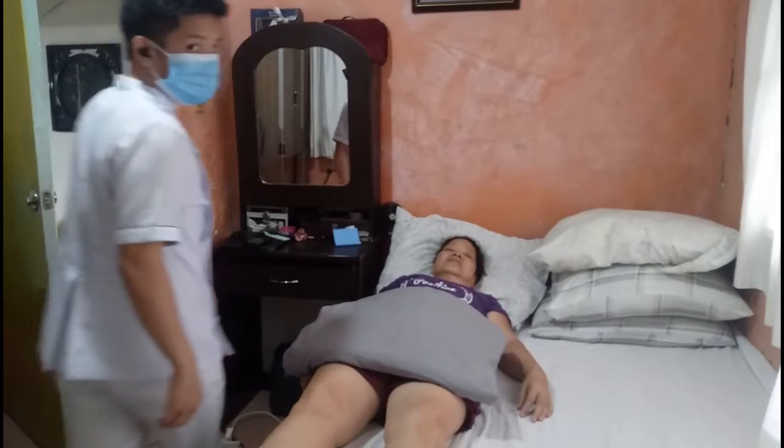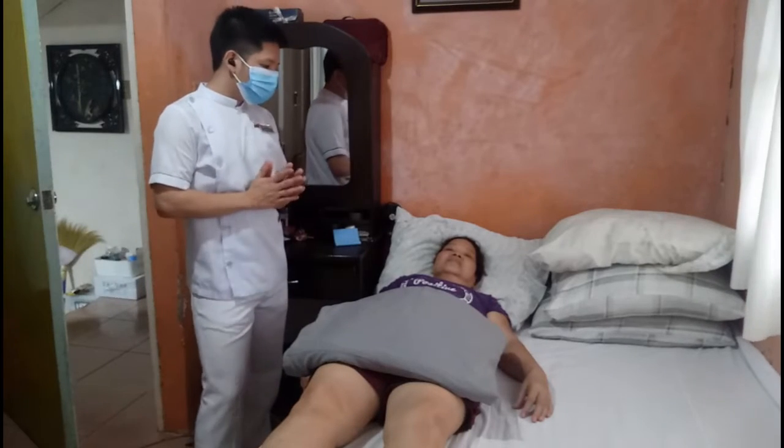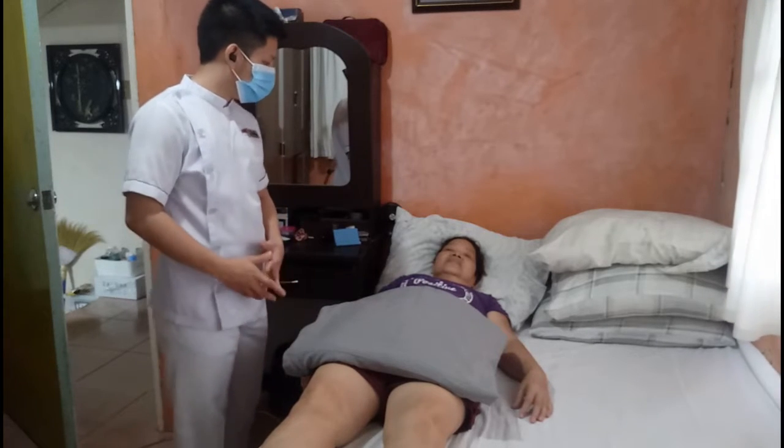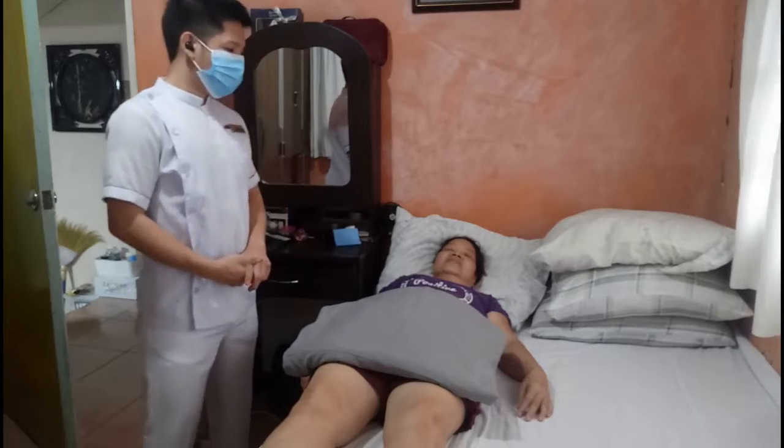Magbihis na po. Before starting any procedure, make sure to ask for patient consent when positioning the part of the body. Before po tayo mag-start ng procedure, okay lang po ba na hawakan natin yung part ng x-ray natin? Okay po, thank you. AP projection of the knee.